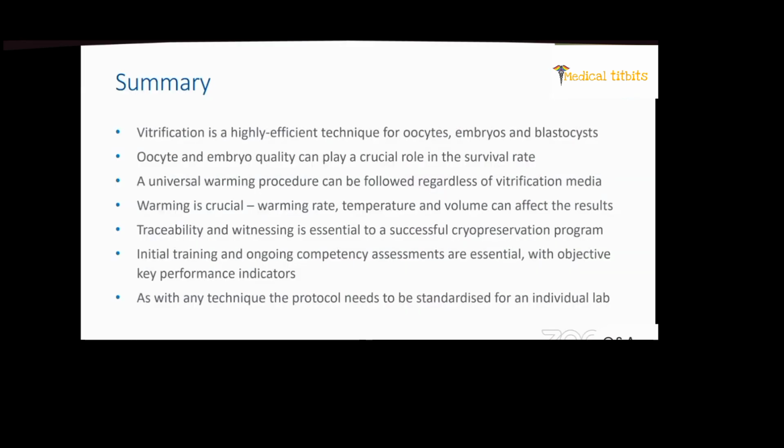So, what can we conclude from this presentation? In summary, vitrification's a highly efficient technique for all stages of human embryo preimplantation development, from oocytes to blastocysts. Oocyte and embryo quality play a crucial role in the survival rate and clinical outcomes of vitrification protocols. The universal warming procedure can be followed regardless of the vitrification media. The warming step is as crucial as the vitrification step. Warming rate, temperature, and volume can all affect the results.